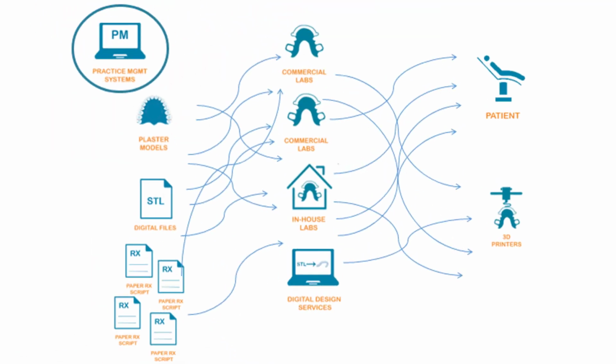Let's get started. This is how we see the current lab prescription and digital workflow for most practices and labs. Looks confusing, right? That's because we think it is confusing and inefficient for practices and labs. There are so many moving components to a digital workflow.